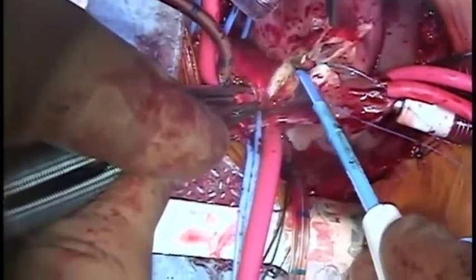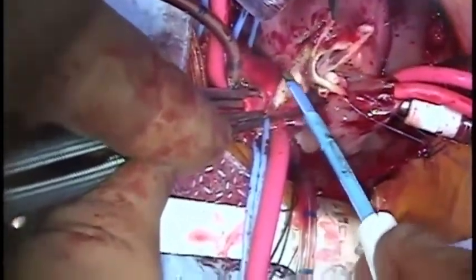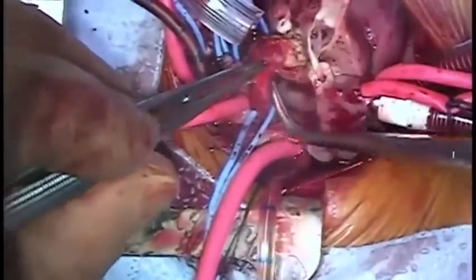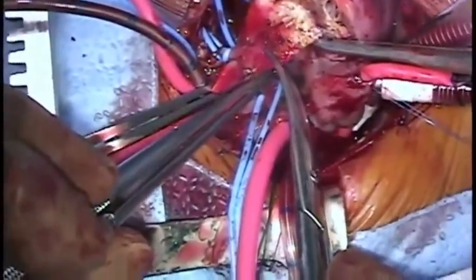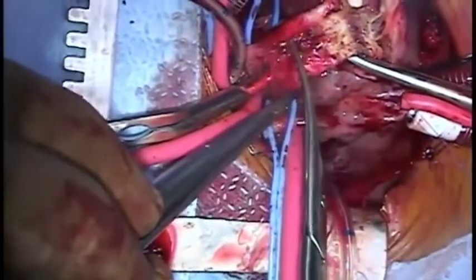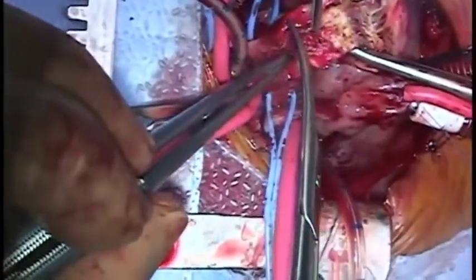Here you can see how the full mobilisation of the aorta, pulmonary and coronary arteries from their epicardial attachments will allow them to take up their new positions without tension after reconstruction. The pulmonary artery is tensioned using a right angle instrument. It is then divided with scissors. Care is taken to line the blades of the scissors with each cut to ensure a smooth edge is obtained, without drifting too far in either direction and damaging either the valve or encroaching on the branch pulmonary arteries.